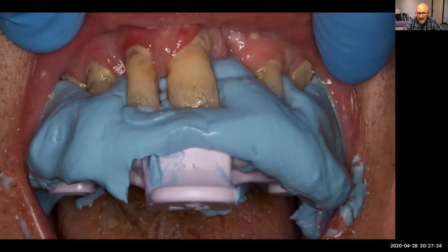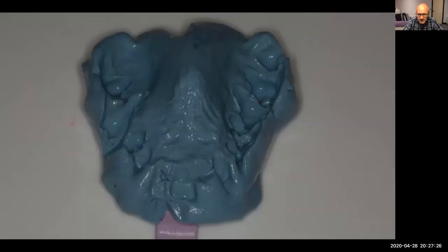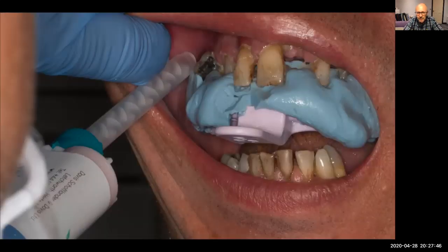I then take it out carefully, like this. And then what I do is I cut in a little groove here, a little groove here, and if I can, another groove on the other side. And this is helpful for the second part of the impression, and it'll make sense just in a minute. Pop this into the mouth.